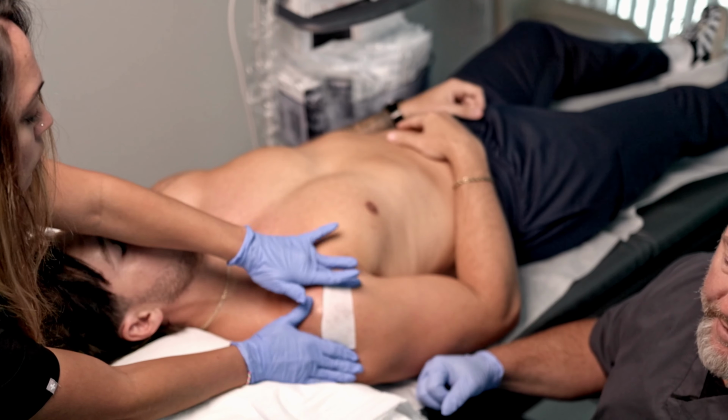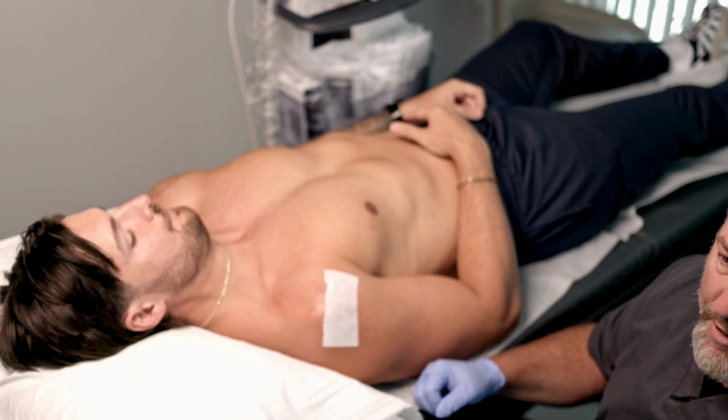I used a little bit longer needle just to make sure because of his muscular stature, and from that standpoint, but I was still able to have enough needle length there to get to that area without any problem. And so I knew he'd do very well with the treatment. So looking forward to having him follow up and let me know how he's doing. Thanks.